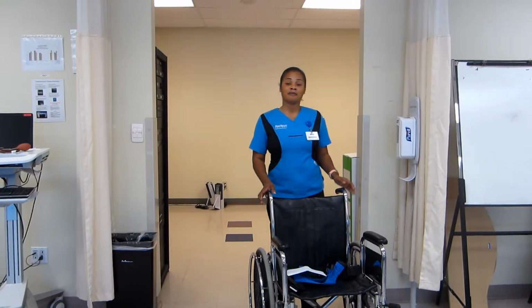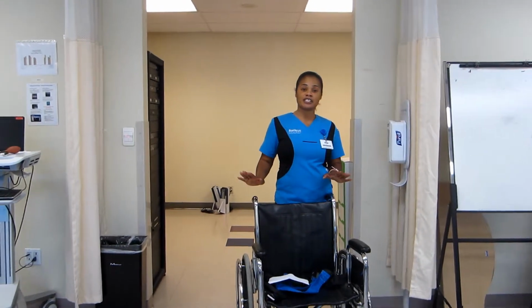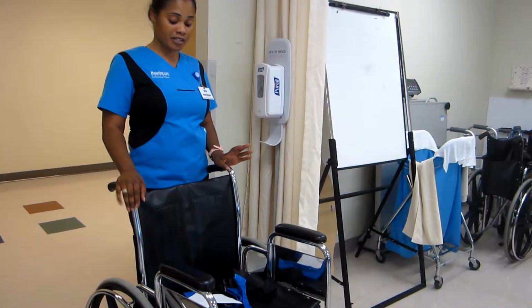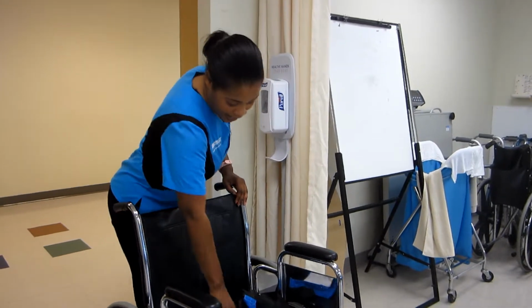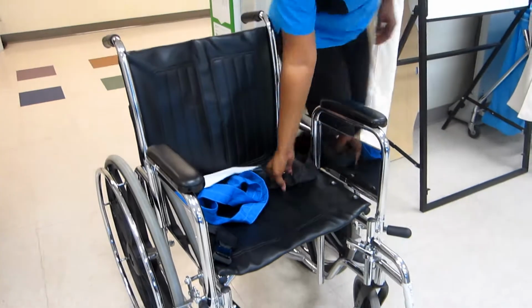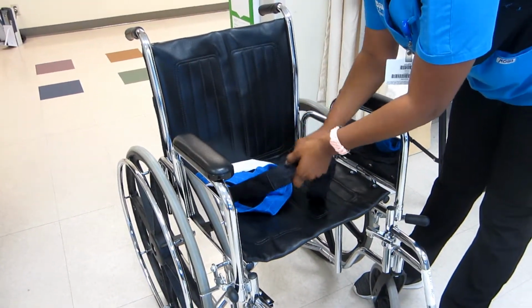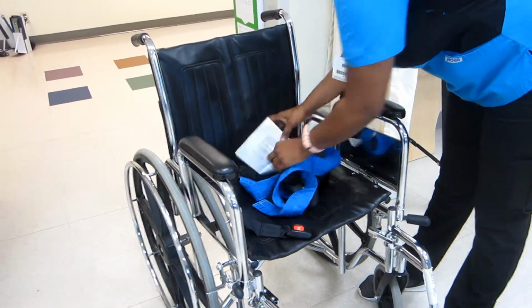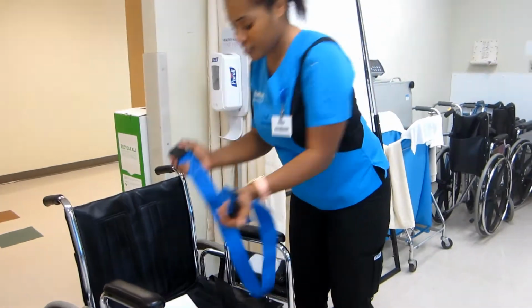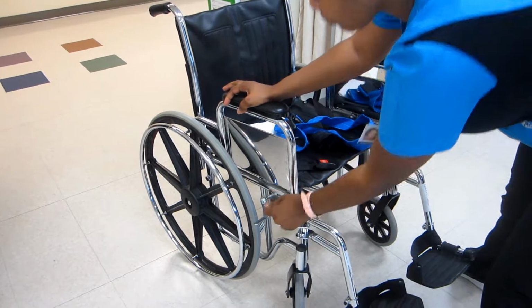Okay, I'll be demoing transfer from bed to wheelchair. For this demo, I have the equipment that I need right here. My patient has left-sided weakness. So I have my transfer belt, I have my MAR, and I'm also making sure that these work. The wheelchair seat belt works, and also my transfer belt works. The brakes on my wheelchair, double check, okay, they work.